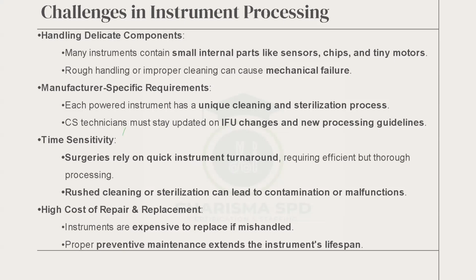Yes, even if you know how an instrument is cleaned, if for any reason the manufacturer thinks they did not get certain things right from the beginning, and therefore makes a change in the cleaning and sterilization process, they will send an updated version of the IFU to all the hospitals that use that instrument.